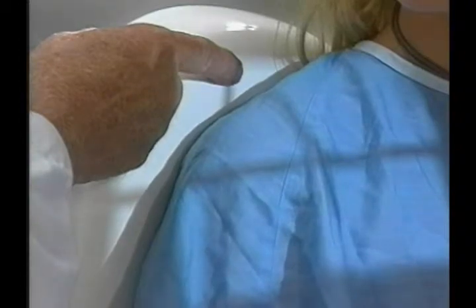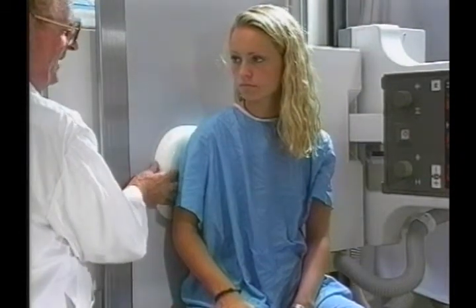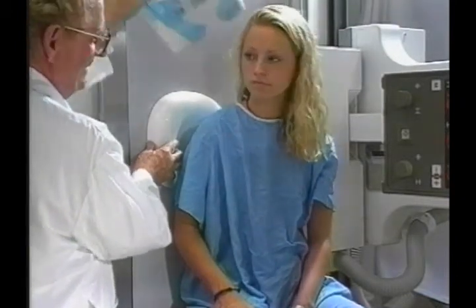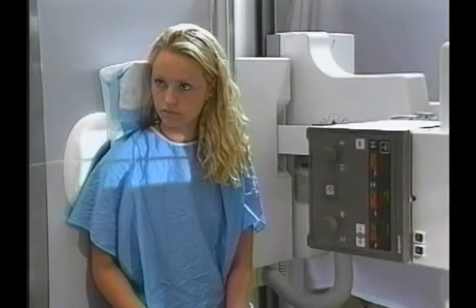To open it, a 10-degree angle toward the feet must be applied. Kyphotic patients lean forward, and the boomerang would fall if we did not insert a cushion to apply pressure against the table. In addition, the angle toward the feet must be decreased.